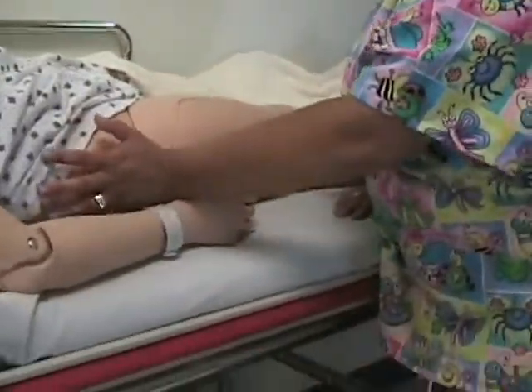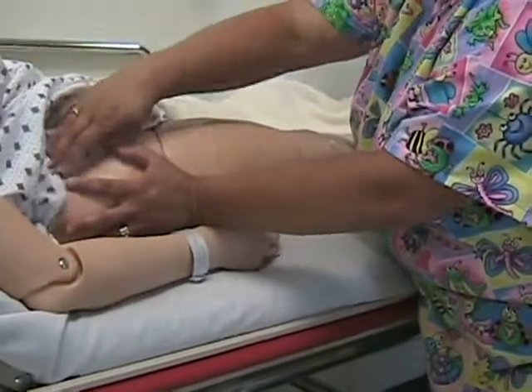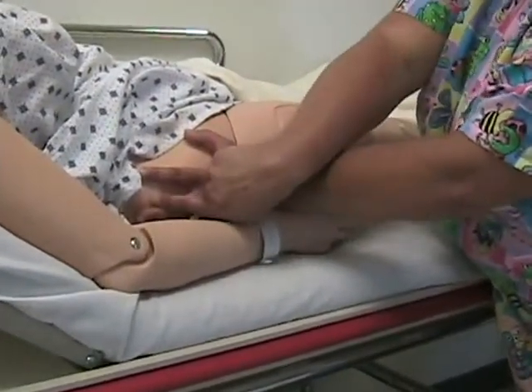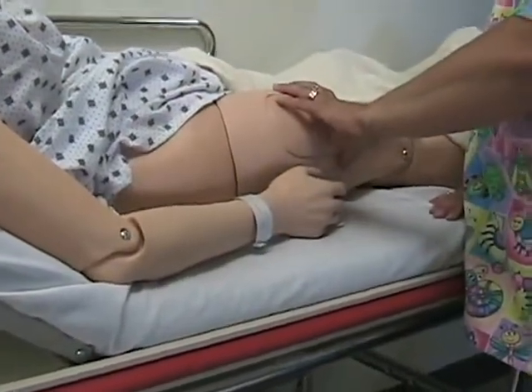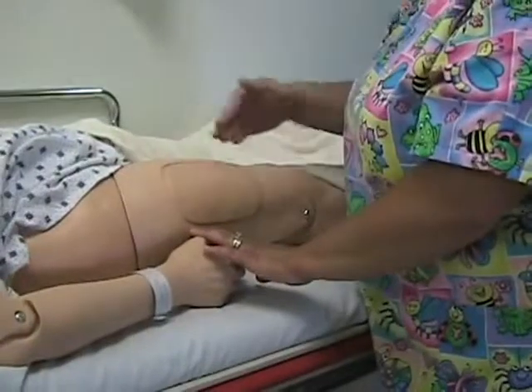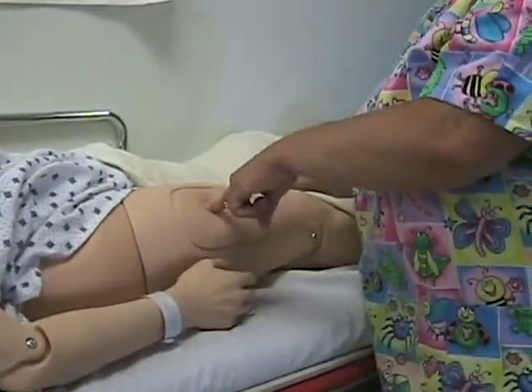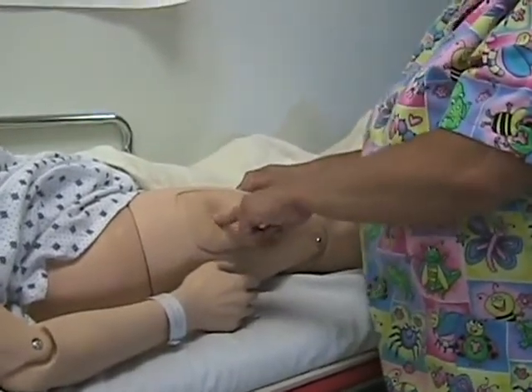We have the ventral gluteal. What you do is put the base of your palm on the hip. Go ahead and make sure this is out of your way. Spread your middle finger and index finger and shoot right between. Then you would go to your vastus lateralis, dividing into thirds of the thigh, horizontal. You would want to go into the middle outer third. So we're going to go ahead and put it right there.